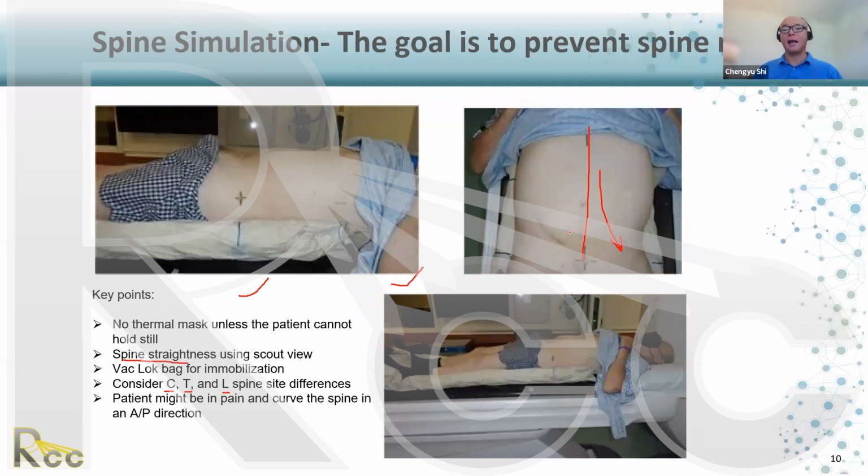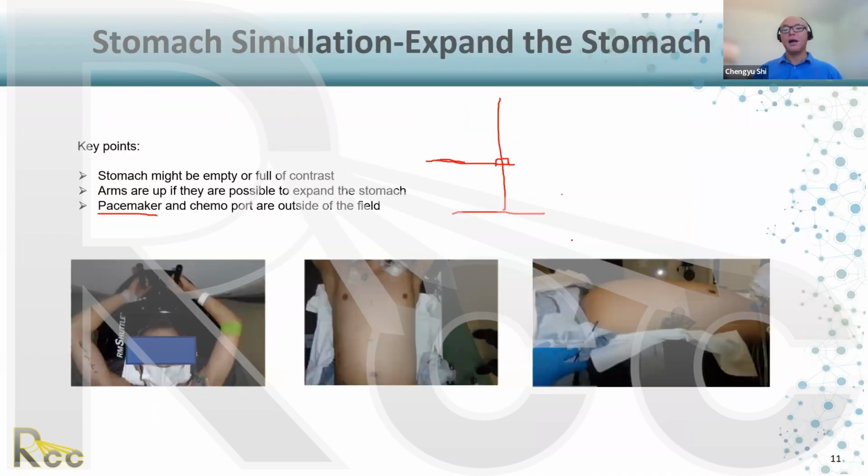The patient will lay on the table. And the couch, you model it in the treatment planning system. And if you don't model, there may be up to 3 to 7% differences. For other carbon devices, it's still okay. Most treatment planning systems have the ability to calculate accurately. If you have metal, like titanium, steel, aluminum, or copper, you give them a correct Hounsfield unit, or your Hounsfield unit to density table should be robust and expanded to high density.